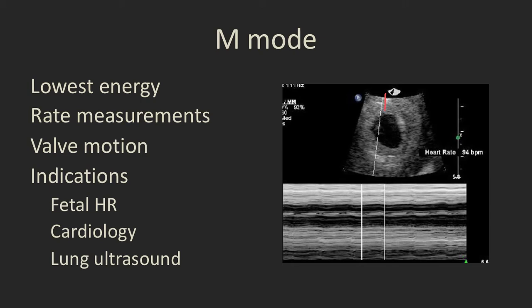Here it's going through some sort of mid-grey area of the anterior uterus, so this is mid-grey. It then has a little black bit of amniotic fluid which is here, this is the embryo in the middle here, black fluid, and then we're out into the uterus again for this bit here which corresponds to this bit here.